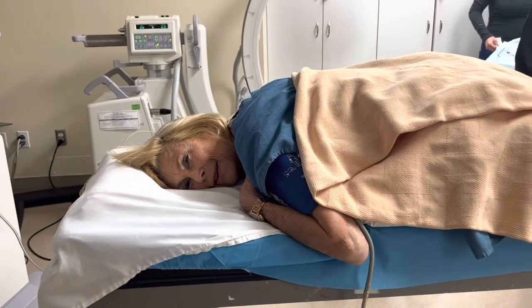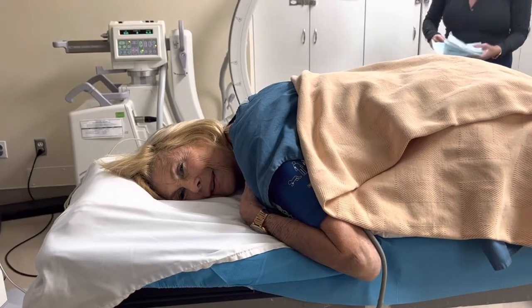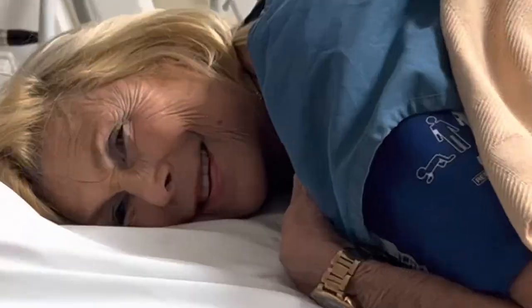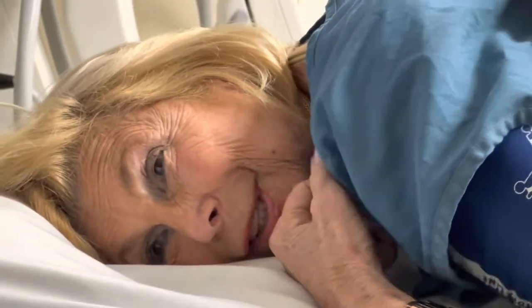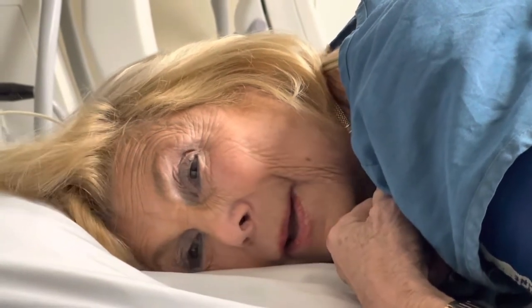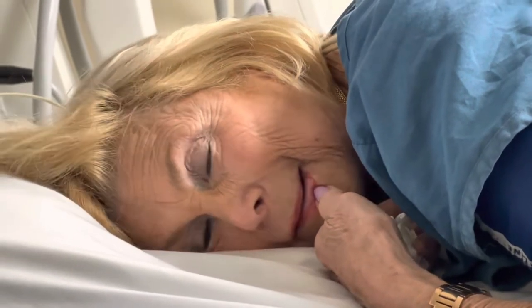Mrs. M, you're now on the other side of the fracture and now we're waiting for the cement to harden. Thank you for making a little video, I really appreciate that. What I wanted people to learn about is what was it like? How did you know you had something wrong? How did you know you had a fracture in your back? Well, when I fell, I immediately knew something was wrong because I couldn't really get up. They had to help me get up. And you had pain right in the back? Yeah. And did it go down the leg or anything? No. So you knew something was a mess right away.